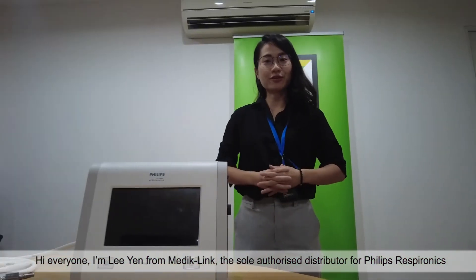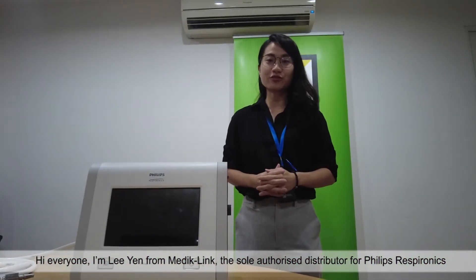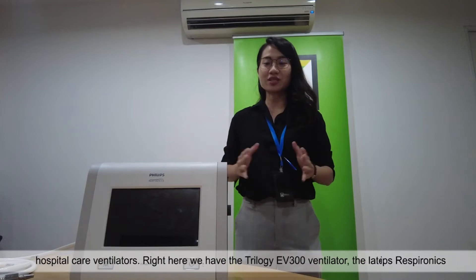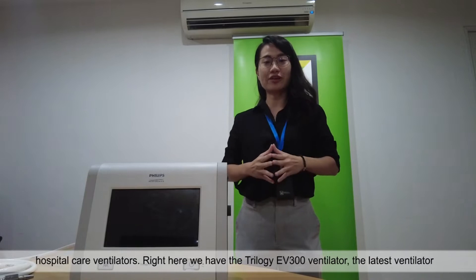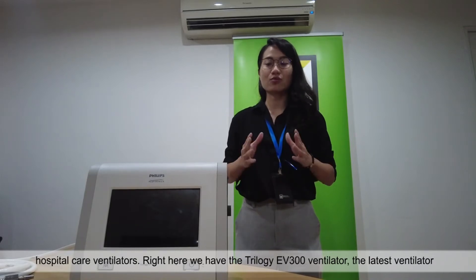Hi everyone, I'm Leanne from MedicLink, the sole authorised distributor for Philips Respironics Hospital Care Ventilators. Right here we have the Trilogy EV300 Ventilator, the latest ventilator designed and manufactured by Philips Respironics.